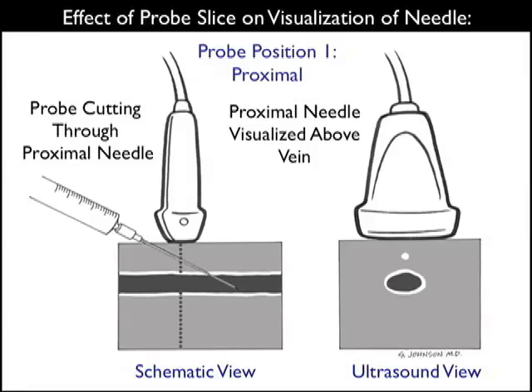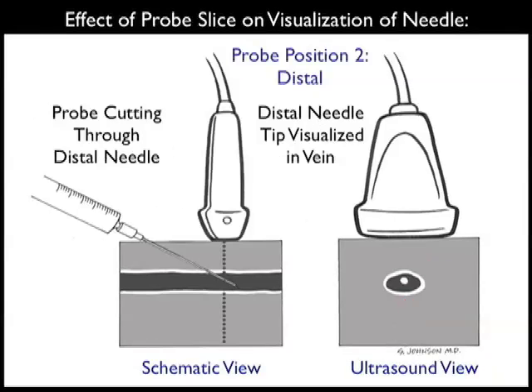When using the short axis technique, one must keep in mind the effect of probe slice on visualization of the needle. Note here the probe is positioned more proximally along the course of the needle, and even though the needle tip is securely within the vessel lumen, we're only visualizing the needle to be above the vessel — giving a false determination of where the tip actually is. Therefore, when using the short axis technique, it's important to move the probe along the course of the vessel to stay in plane with the tip of the needle as you advance it into the vessel lumen. Here we've moved the probe more distally and now we're more in plane with the tip of the needle, showing successful cannulation with the tip right within the vein lumen.